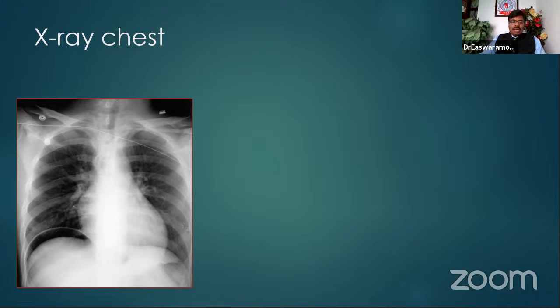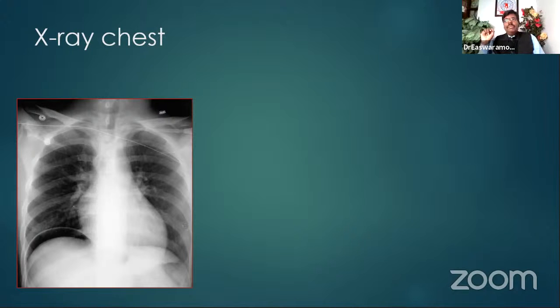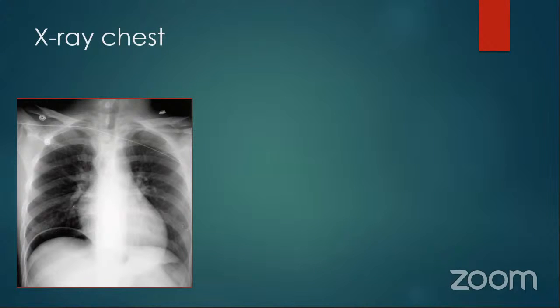So very well done, Bharat. I think this is the thing they'll ask you. If they ask you in what percentage of the people you will get air under the diaphragm if they have a case, for example, you tell me what are the common causes for perforated viscus. If I ask you, can you unmute yourself? Try. Yes, sir. Any ulcerations, sir, or duodenal ulcer perforation. Good. Next? Any tumors, sir, abdominal tumors.